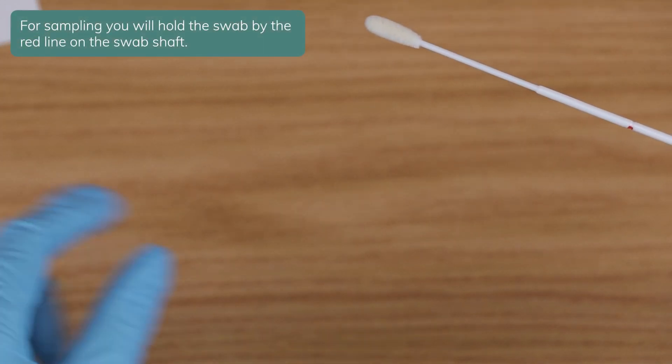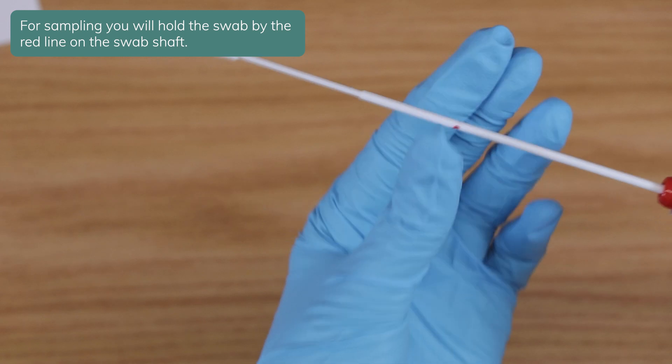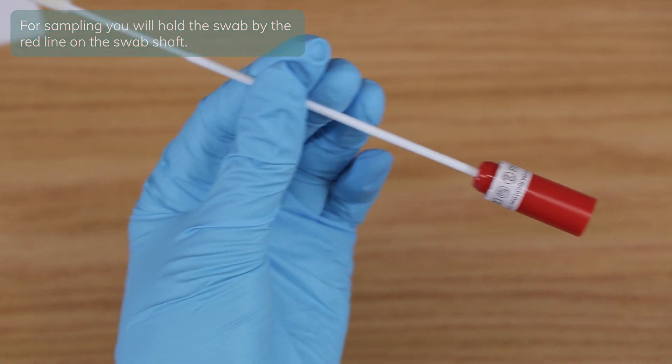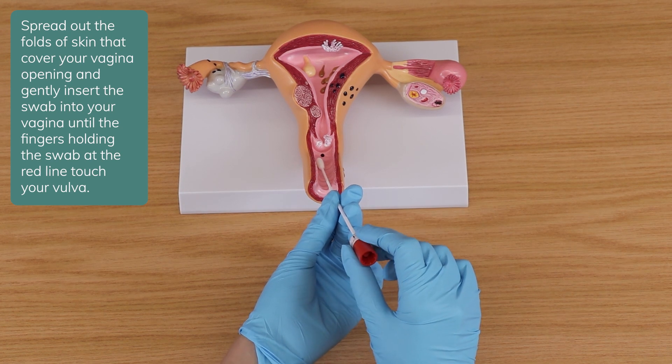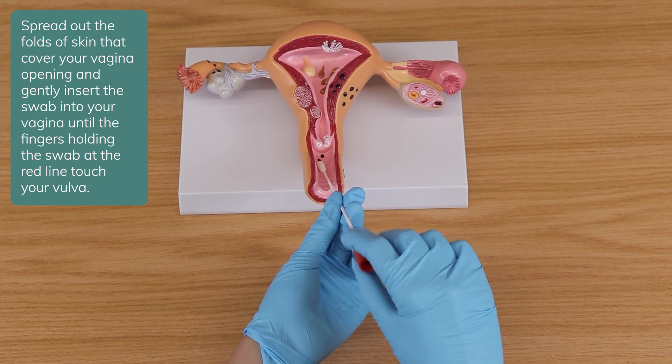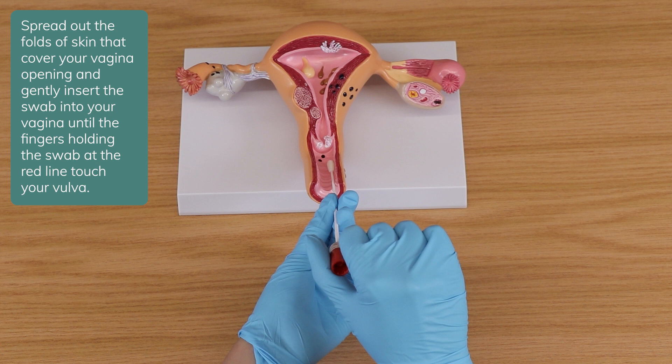For sampling, you will hold the swab by the red line on the swab shaft. Spread out the folds of skin that cover your vaginal opening and gently insert the swab into your vagina until the fingers holding the swab at the red line touch your vulva.